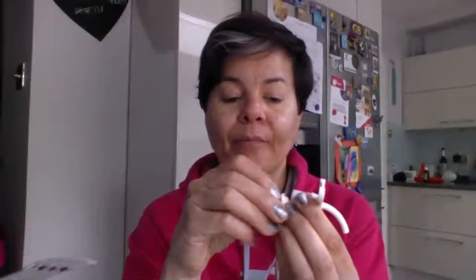Zoe's tracheostomies are called Bivonas. They're made out of silicone and they have a metal coil in this part, which used to not be able to go in an MRI scanner, but apparently is safe now. And so they're very bendy and much more comfortable. There's another type called a Shiley, which is plastic and quite hard and firm and doesn't move at all. Those ones, in the old days, used to be disposable. You could only wear one for a week and then you'd have to throw it away and put a new one in.